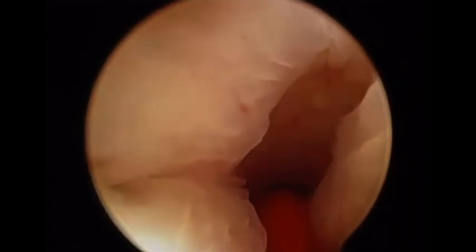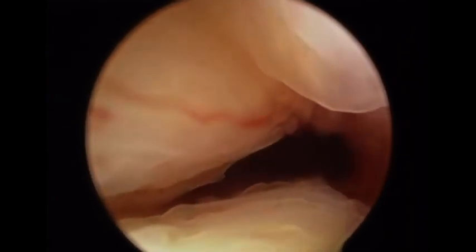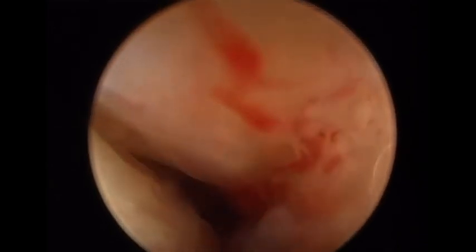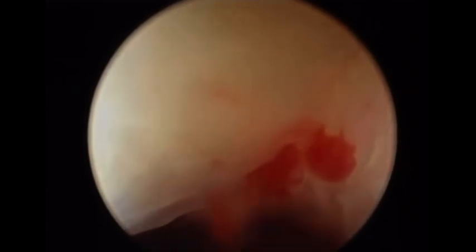You can see that the cavity has some blood and blood clots. Continuous irrigation and manipulating the fluid pressure to push a jet wash creates turbulence and cleans the content of the cavity. There is no worry of fluid overload at this step — you are still in the cervical canal. Unless you have a jet wash, you will not be able to drive safely.